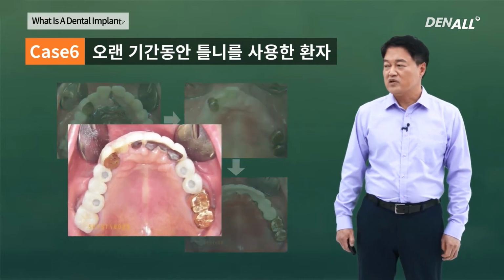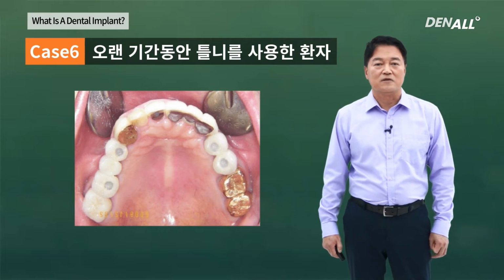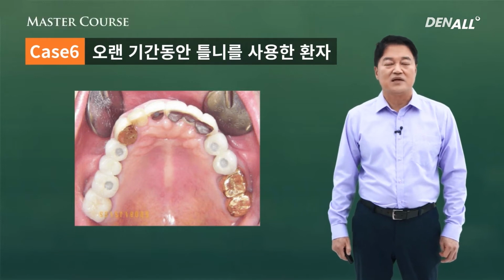If you look at the completed image, the palate has been restored to a normal state, and when the patient chews, the patient does not feel any pain and can eat with ease.